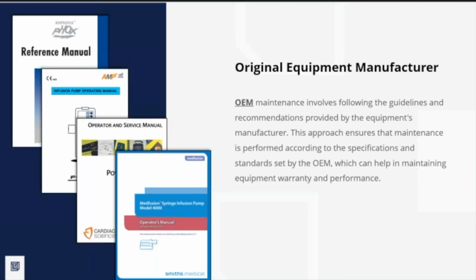So, if equipment's under warranty, there is something to note there. If you want to keep that warranty in place, you might want to wait till after the warranty period expires where you start doing AEM on that. So you might void your warranty if you do something outside of the norm. So something to keep in mind there when you're doing that.